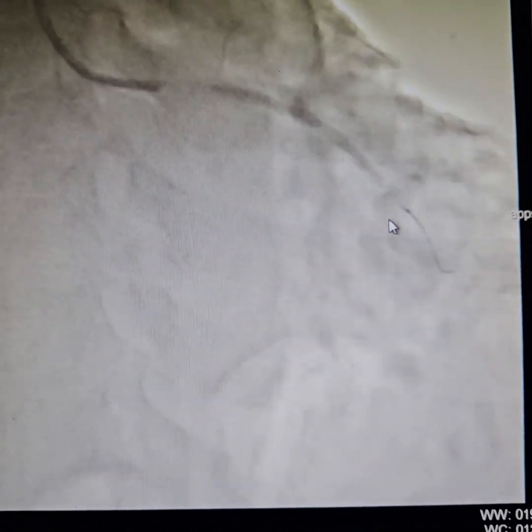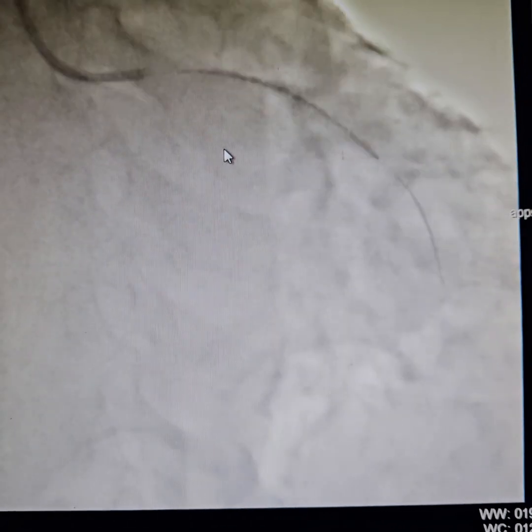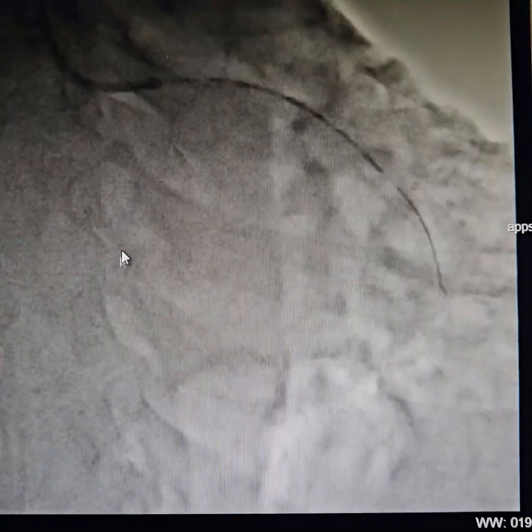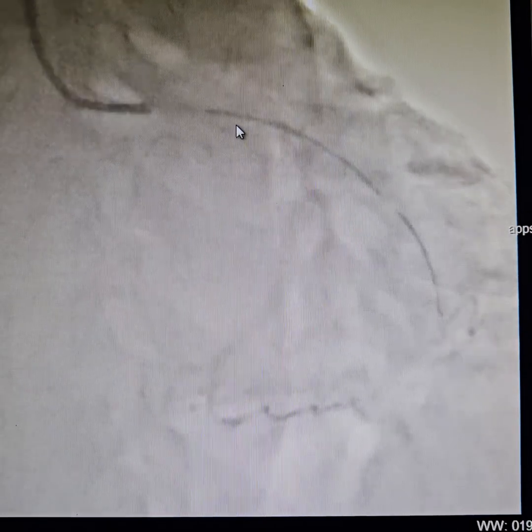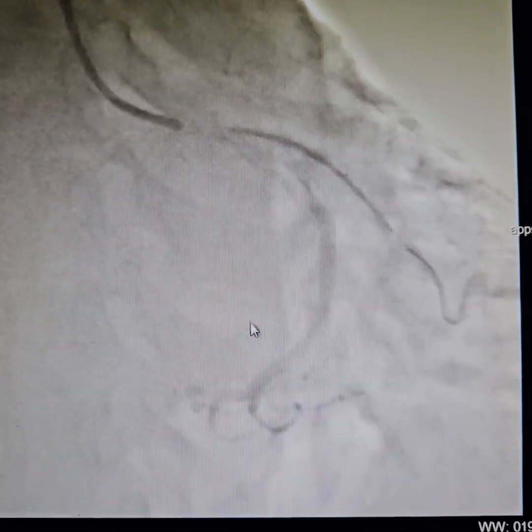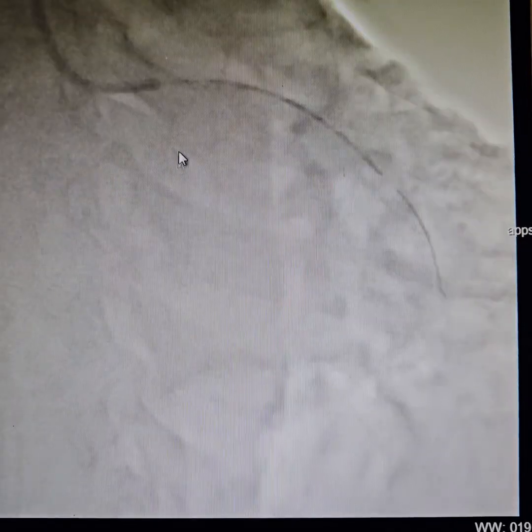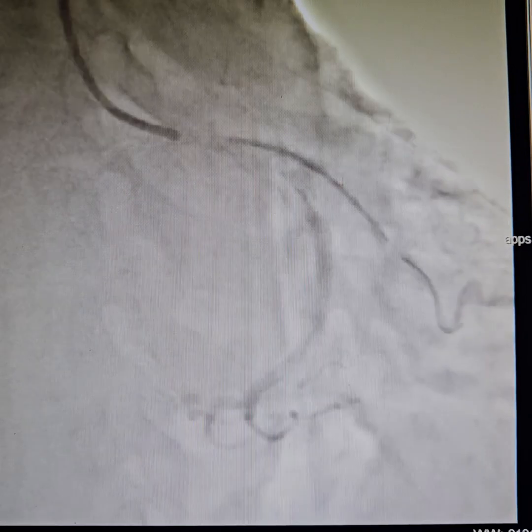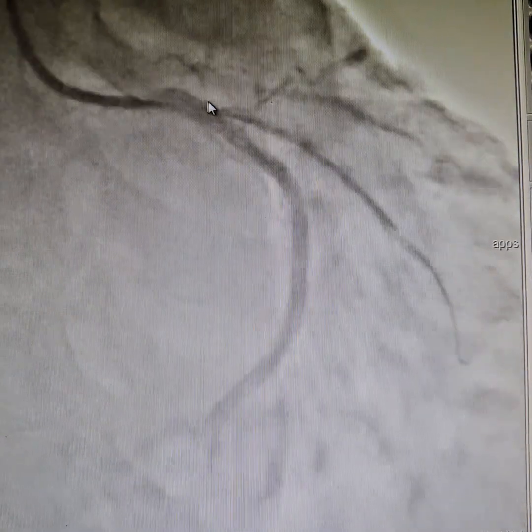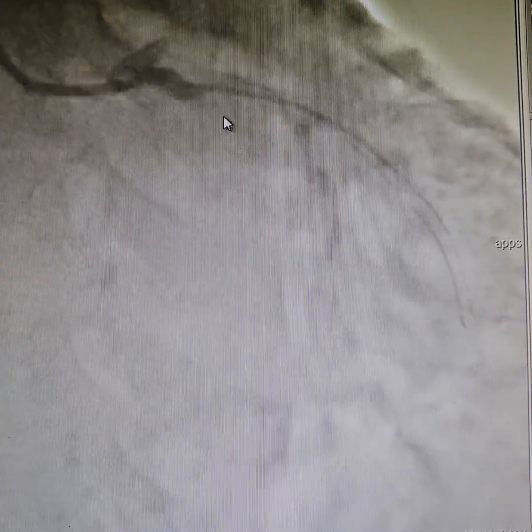Now this is the stent — a 2.75 by 48 mm stent. We've inflated it. What is very important here is that you do not miss the ostium. You try and put your stent coming a little into the main artery.